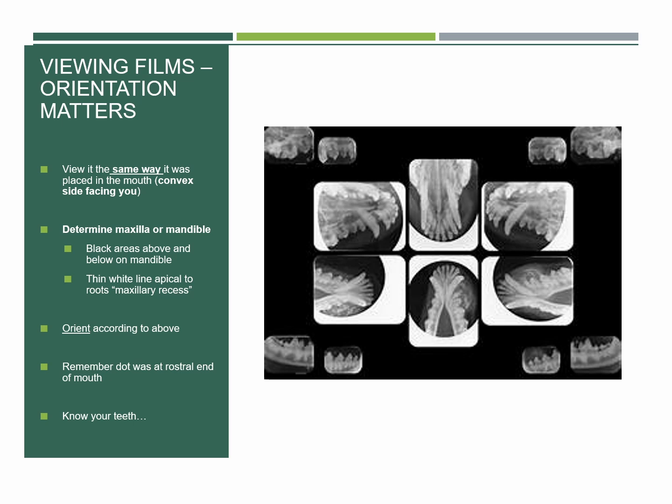Orient according to above, right? So you're going to actually learn that it matters how you orient them. Remember, the dot was at the rostral end of the mouth. And here's a little hint. Know your teeth. You should know your teeth by number. Because when we talk about 404, 408, whatever number we're using, you want to know which ones are which and how to orient them as such.